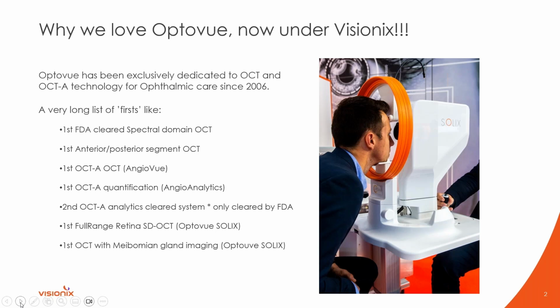They're the first company that came up with a spectral domain OCT. They're the first company that came out with a combined anterior posterior segment OCT. They're the first company that came out with OCT-A, and really the icing on the cake is that they have what we call angioanalytics, which allows us to quantify the things that we're seeing on OCT-A, which we'll go into tonight. This is the only company that has angioanalytics, which really makes the interpretation so much easier.